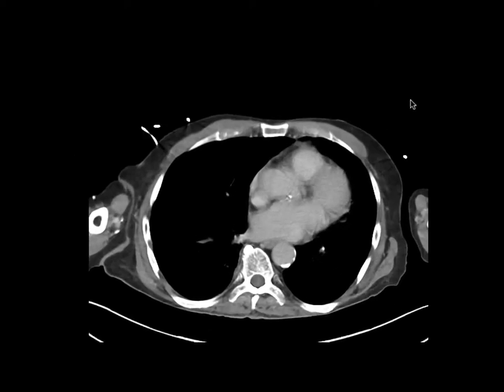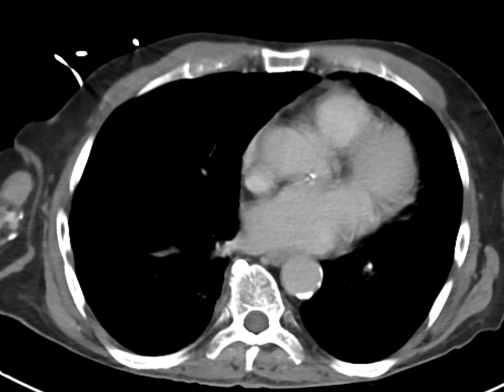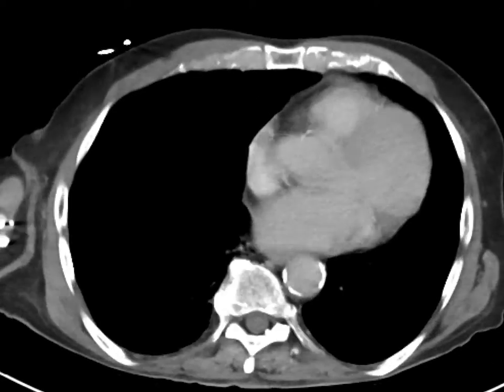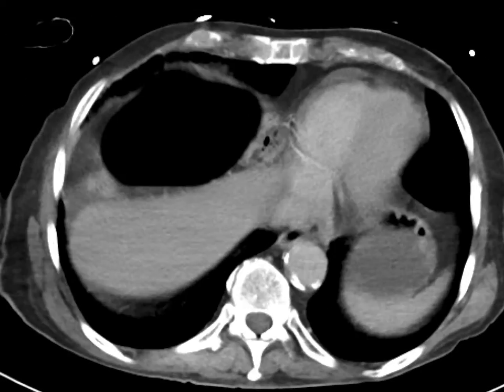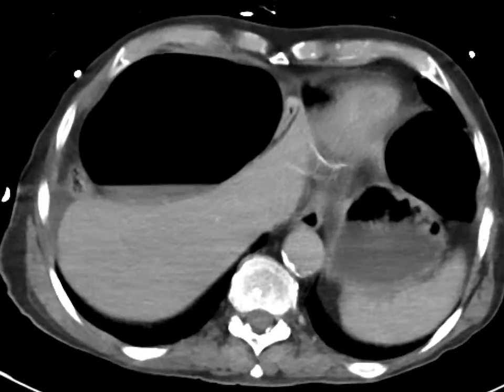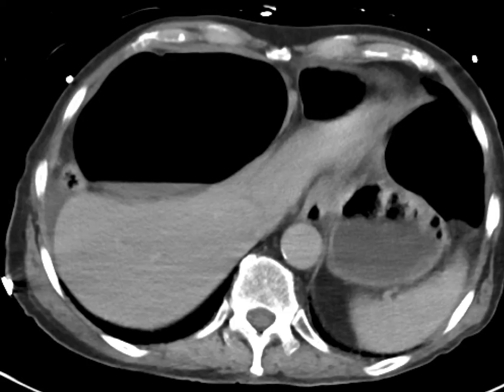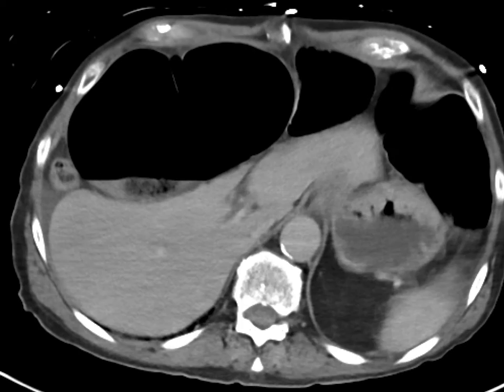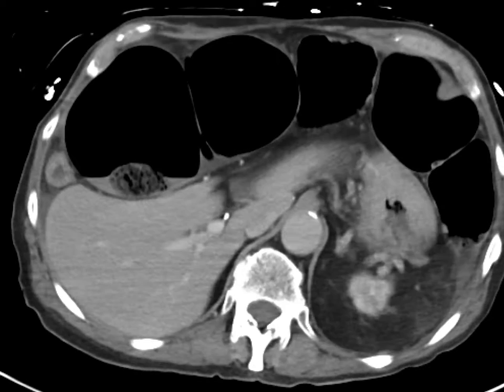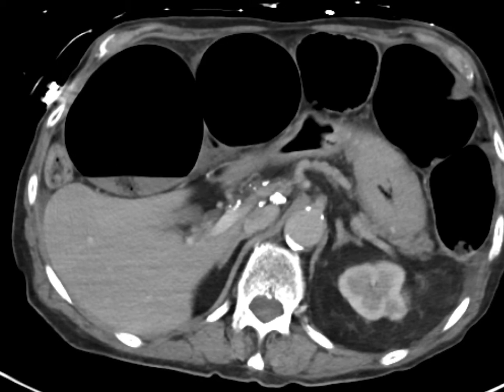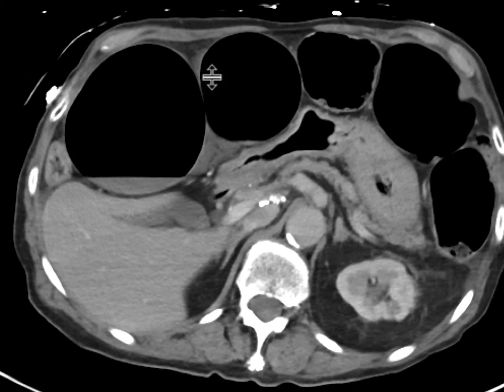This patient comes in with abdominal pain and gets a CT scan with intravenous contrast. Immediately, when we look at the first couple of slices, there are numerous distended loops of large bowel.